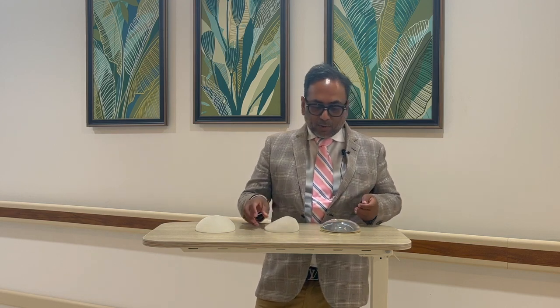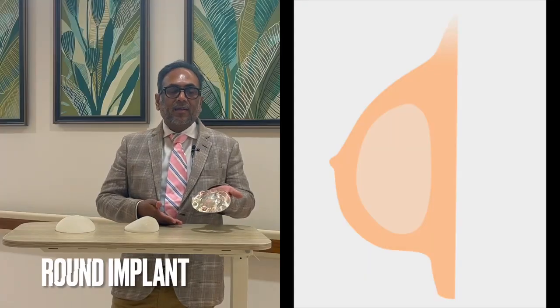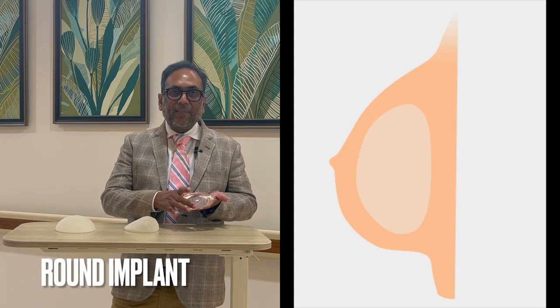Now, let's talk about the shapes. The most commonly used implant is a round implant. So this has a specific diameter, and for a given patient, based on the base of the breast, the implants are chosen and they are inserted. So you have the round implants like this, which are most commonly used.